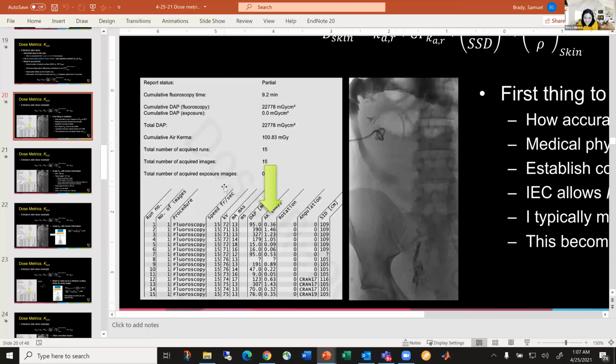Yeah, right. As a radiologist, or an interventionalist, they're going to put that in their report, but it won't be as complete. They might say the cumulative dose and the patient got blah blah blah milligray. But having this part of the study on PACS, we can always go back whenever we want, and you can look at all of these 15 or so different runs. Anyway, I highly recommend you make sure it's archived.